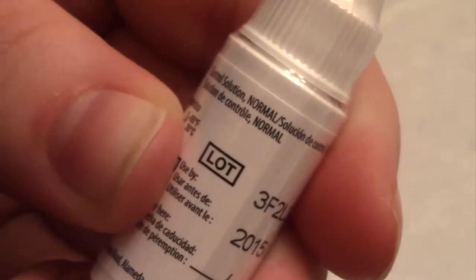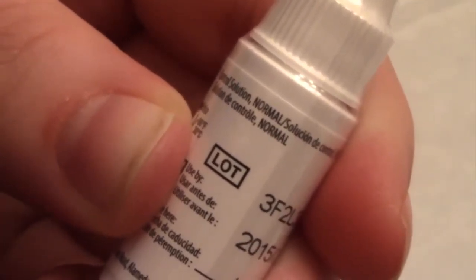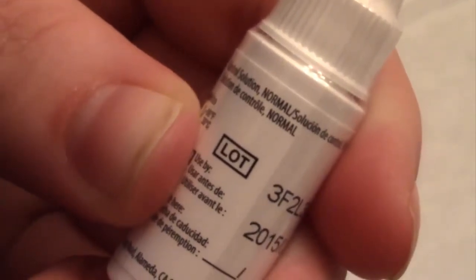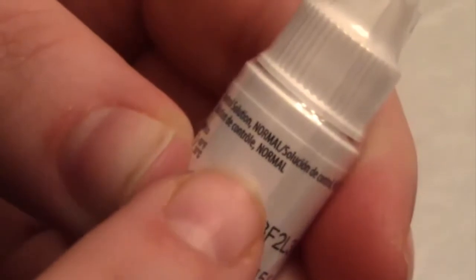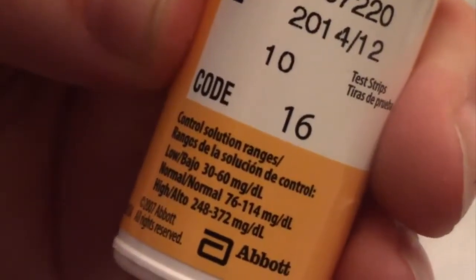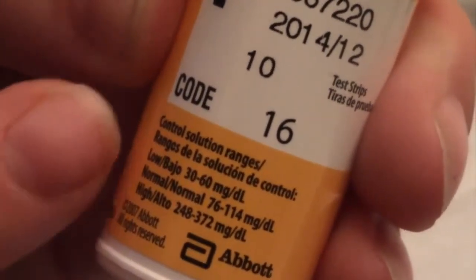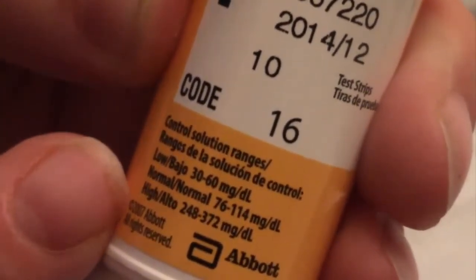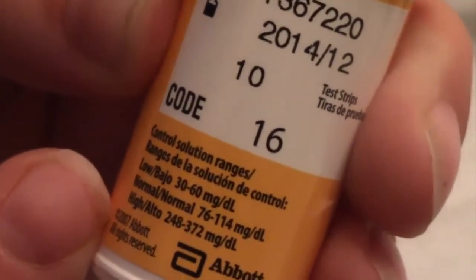For the Freestyle Light meter, there are three different control solutions: low, normal, and high. You can find out which solution you have by looking right above the lot number. On each test strip bottle, there will be a control solution ranges column for low, normal, and high. When doing the test, if the result is consistently outside of the ranges, stop using the meter and call customer care.